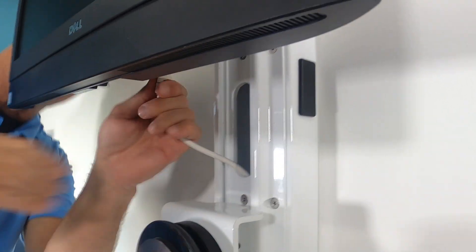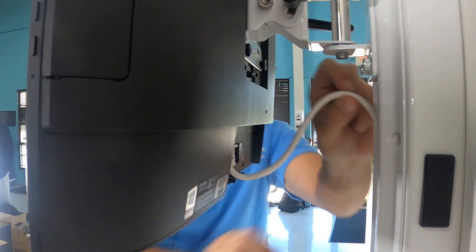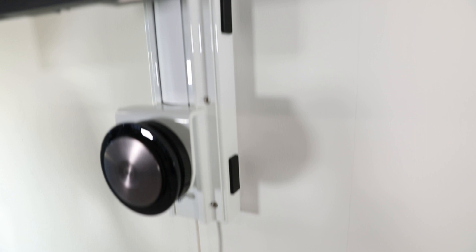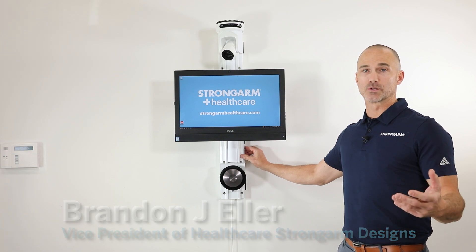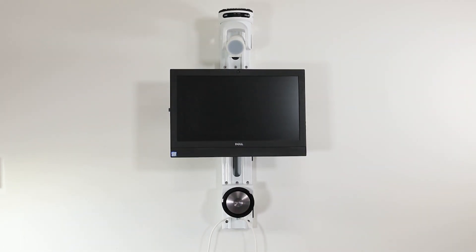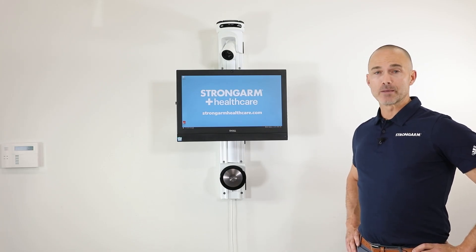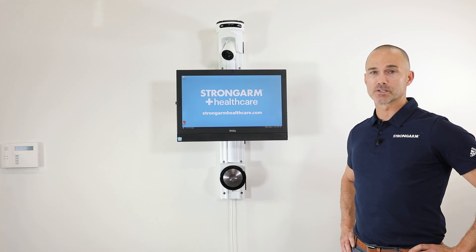Run the cables out of the holes in the cavity. Ultimately, when looking for a telehealth or wall-mounted solution in healthcare, you want to make sure that you look for an all-metal product from a durability perspective. With Strongarm Healthcare we offer a lifetime warranty — it is vitally important to us as a company that we know our product is going to support and last as long as the nurse needs it.